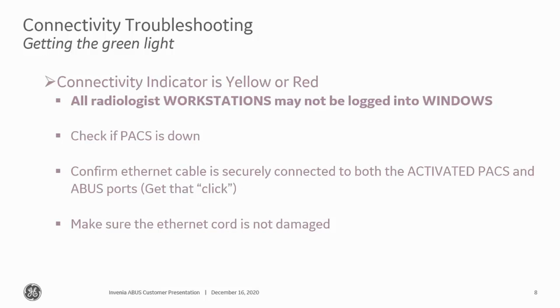And all you need to simply do is, once you know you've got connections, all your connections are good, just select that yellow triangle in the completed work list, and then all the way over to the right, you'll see the computer monitor. Select that, and then it will give you your different destinations, and then you can select which destination it needs to go to, and just determine which connection wasn't green at the time that you scanned the patient.